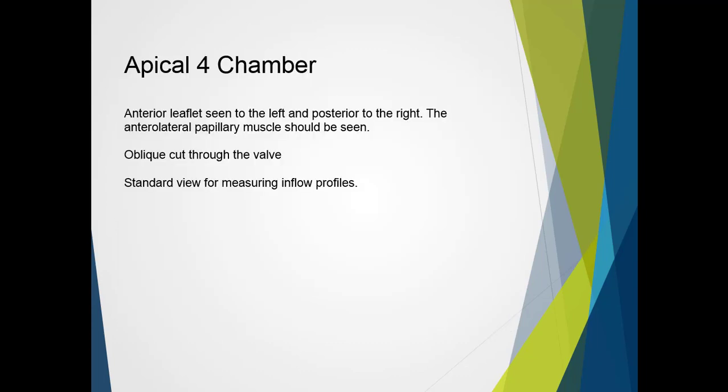The apical four-chamber view shows the anterior leaflet to the left and the posterior leaflet to the right of the image. The anterolateral papillary muscle should be seen as this view attains the anterolateral LV wall. This view is an oblique cut through the valve and does not run along the leaflet commissure. It is important to note that this view is standard for measuring inflow profiles — pulse wave for diastolic function and stroke volume assessments, and continuous wave for forward flow intensity and stenosis evaluations.